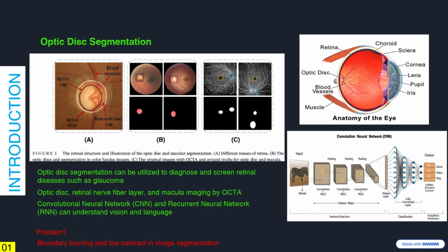But deep learning can help further improve this imaging from OCT, giving better contrast, better segmentation, and improved clarity of the image itself.